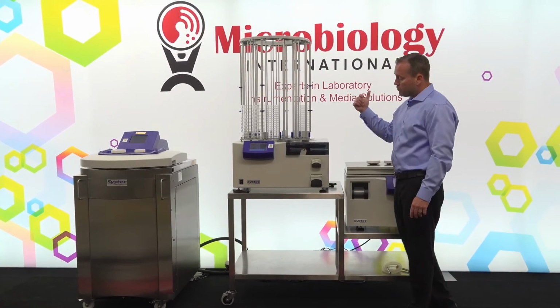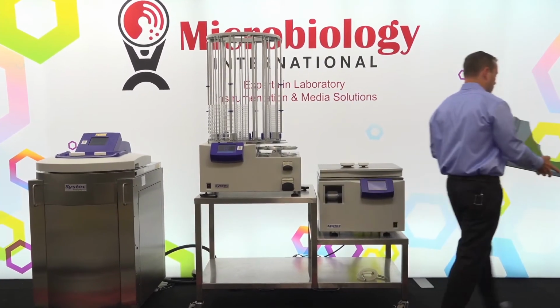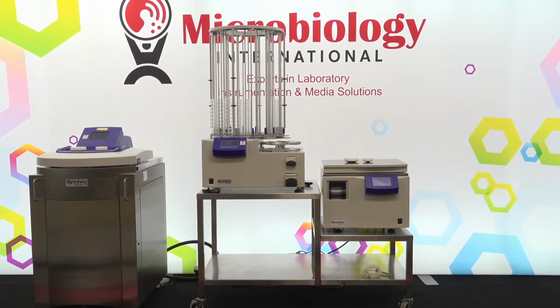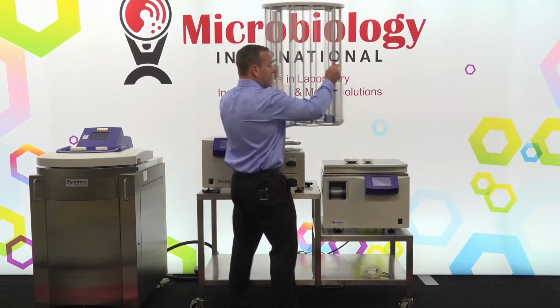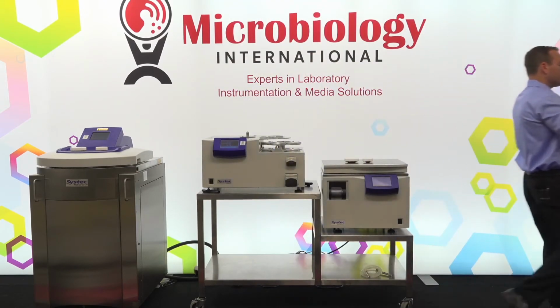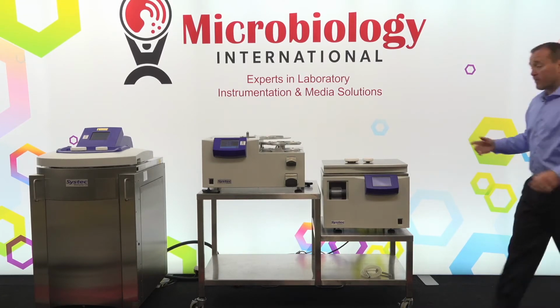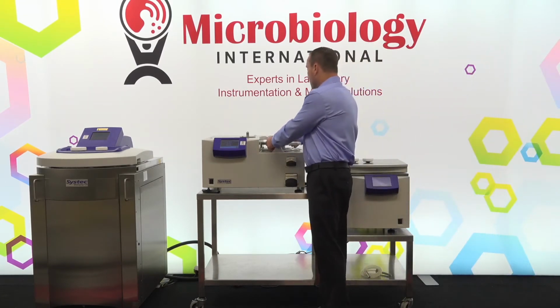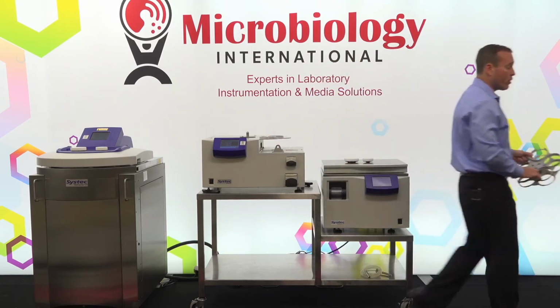So you saw me remove these items, so we're just going to take them out again. Now, the tube filling device is an option that can be purchased at any time. All of the systems are pre-programmed to have the tube filling option available inside of the programming, but what we would need to do is add the components that we need for the device.